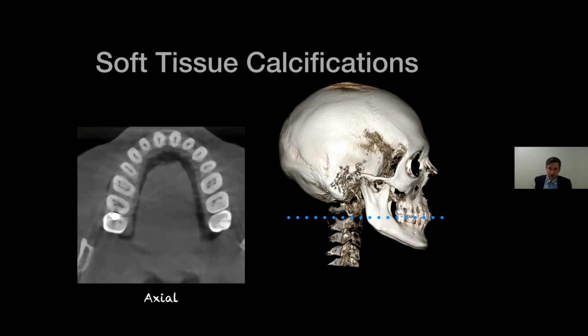And if you find something that you're not sure exactly what it is, you could send it to your colleague down the street, an oral surgeon or an oral radiologist. By definition, you can do that as well. It's not like medicine where, in the hospital, every scan taken has to have a medical radiology report. Dental's kind of like the Wild West. You have the ability to call the shots in your office, and as long as the scan is being read and documented, you can do that yourself.